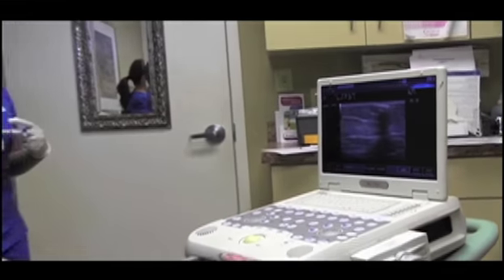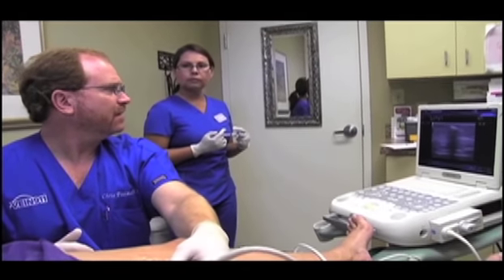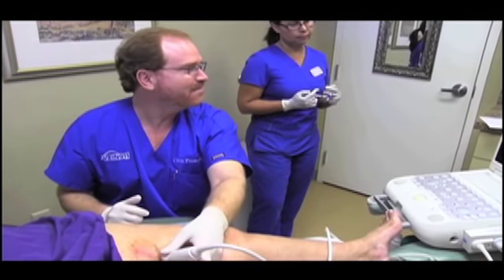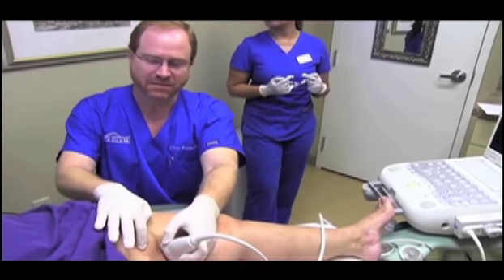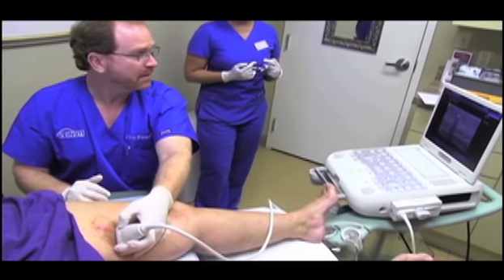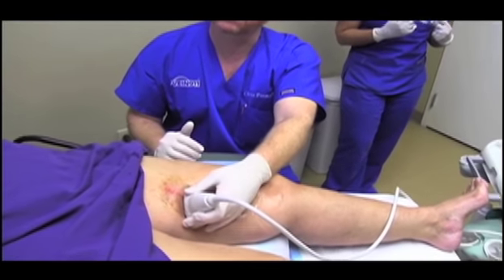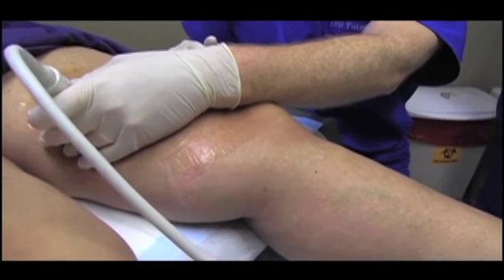That foam acts instantaneously — it destroys the wall of the vein. Over weeks and months that vein will be reabsorbed by the body, so there's really no need for surgery. I sometimes make graphic analogies, but what we're doing here is producing road kill of these varicose veins. They'll become a little tender and hard cords over the next few weeks. She's going to say, 'Is this normal?' I'll say yes and give her a paper confirming it's totally normal. Then the body absorbs it — it's a lot like road kill.